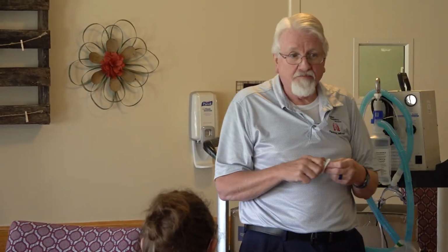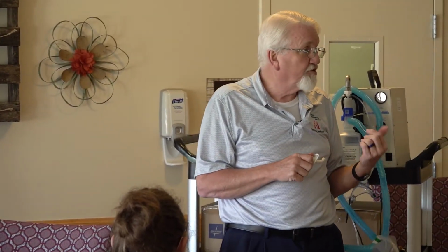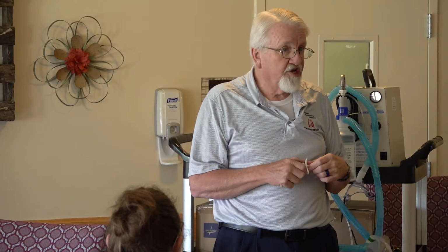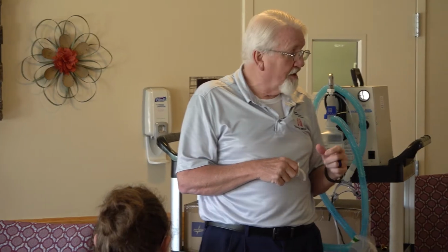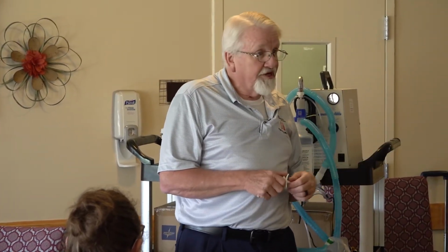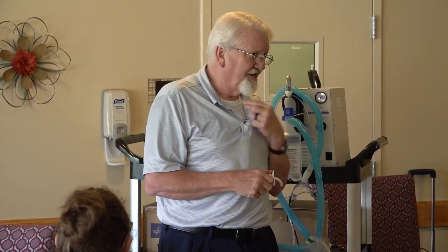For a patient to eventually become decannulated, part of their criteria is being able to be capped for a certain period of time without needing suctioning. So if you go in and Bob says, suction me, and he's got that red thing on, I'm going to go find my RT or my ST and say, why is he capped?